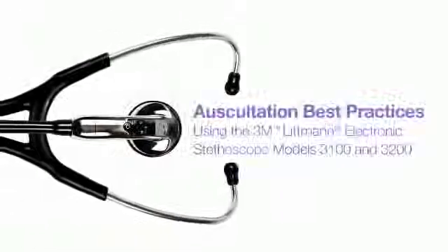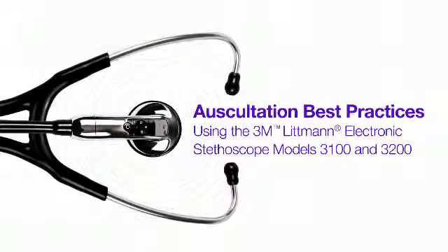This video covers the basic techniques for optimizing sound quality when using the Litman Model 3100 and 3200 stethoscopes.